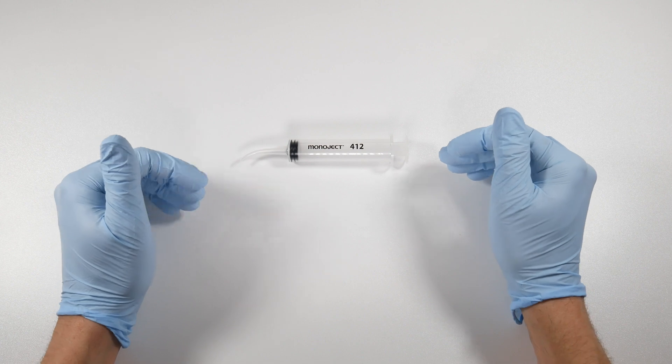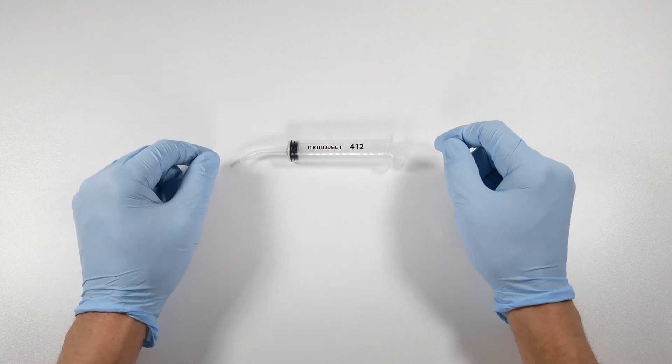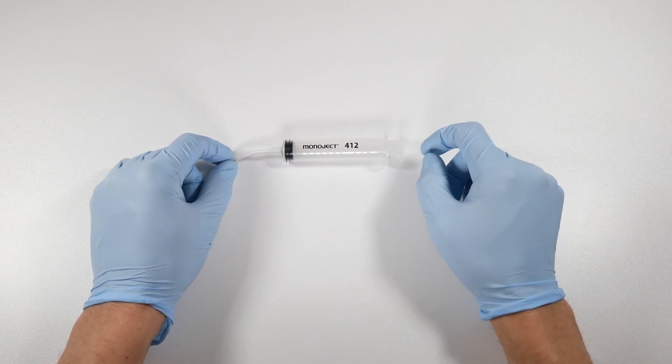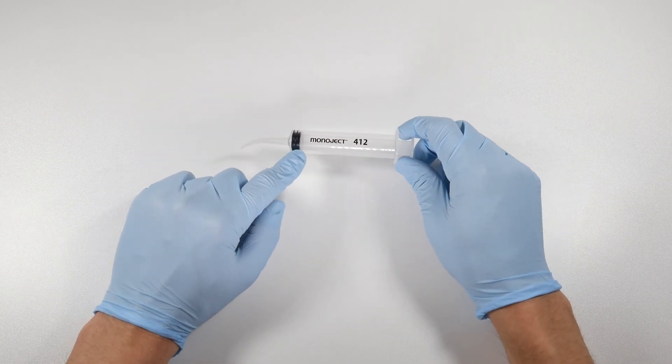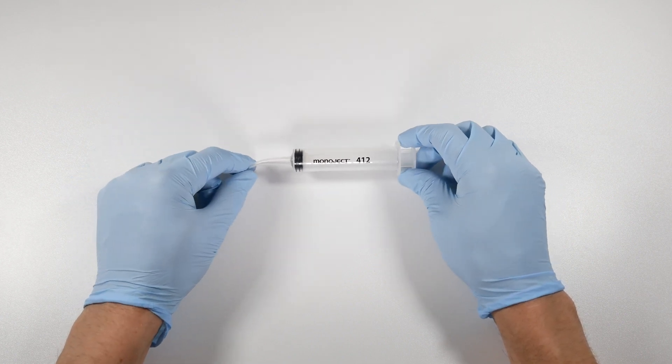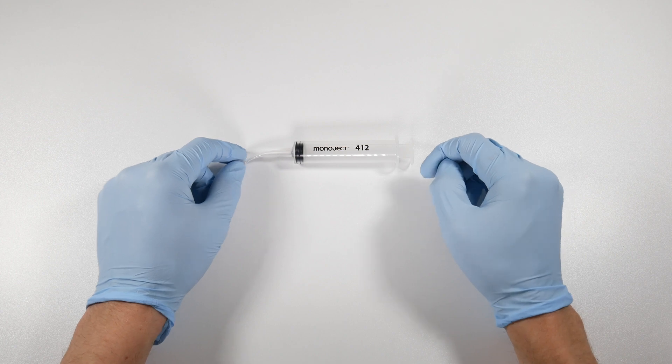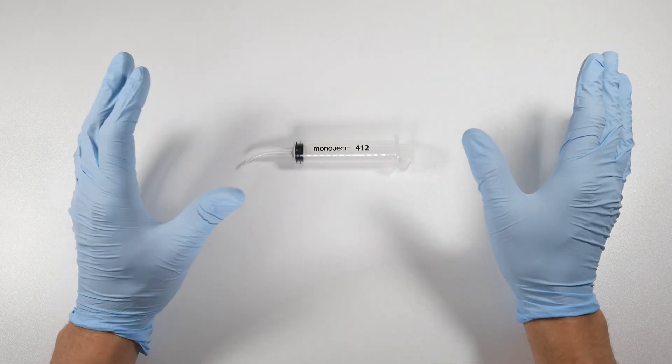Now a Monoject syringe is a 12cc or 12 milliliter syringe, meaning that's the amount of fluid that you can put in it. Normally you're going to load this with sterile saline for an extraction procedure, and I would typically only use these if I'm taking out a tooth other than a third molar.